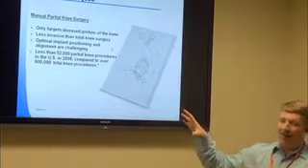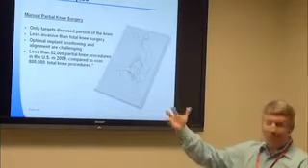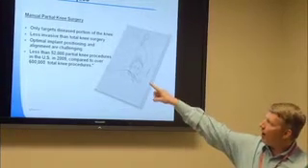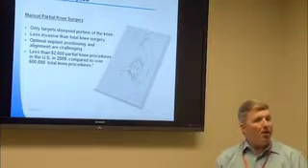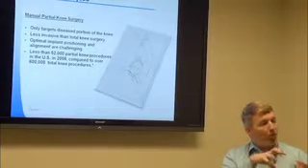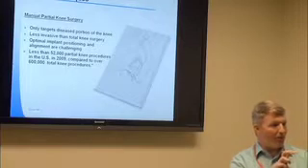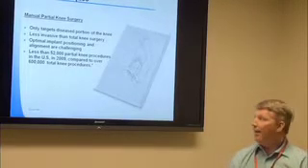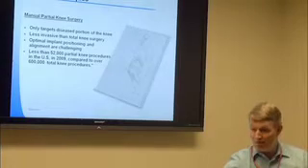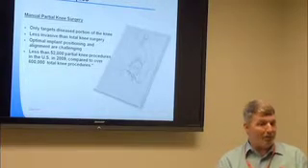And the challenges have been that optimal implant positioning and alignment are very, very challenging. And that's why this surgery has been around a long time. We've actually been doing this particular surgery a long time. The problem has been this third comment right here. Optimal implant positioning and alignment are challenging. The reason they're challenging is because everyone's anatomy is different. And these typical protocols call for us putting the components in after you've burned a certain amount of bone away. You replace that amount of bone with a component, or a metal or plastic. And oftentimes positioning these are inaccurate relative from this person to this person. Okay, so what we have been able to do is incorporate the individual's anatomy, and we'll talk about that in just a second.